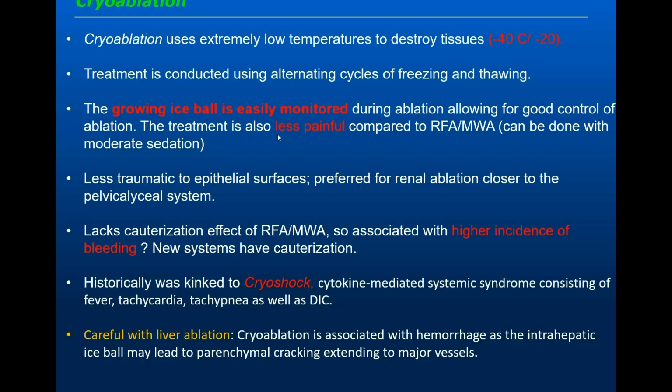The treatment actually is remarkably less painful. Think about it like when you get any trauma to your hand or your foot, the first thing you do is you get some ice and you put it on it, because the ice numbs the nerves. And this is the beauty of this, that now we can even do these ablations using just moderate sedation. With microwave or radiofrequency ablation, we do general anesthesia because it's painful. But with cryoablation, we can actually, in select cases, do it with just moderate sedation. This is the big advantage, guys, that I want you to remember, what I teach my medical students. Ice is nice. That's how we call it.